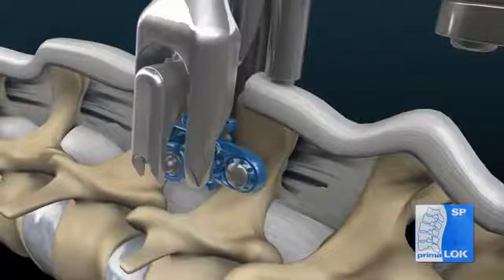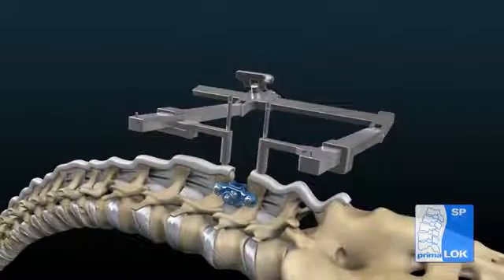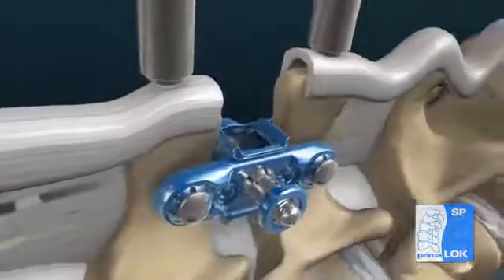Gently rock the inserter to disengage the spherical tabs from the implant. Confirm placement with fluoroscopy and visual inspection prior to final locking of the implant.